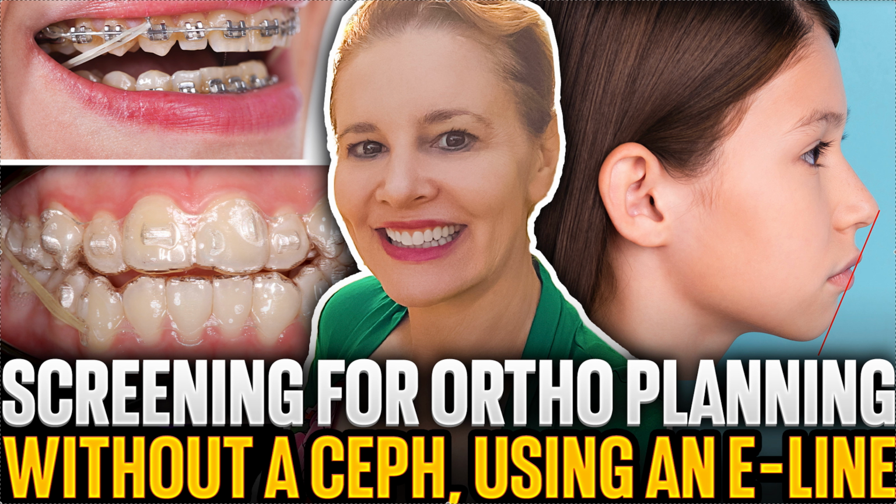Let's talk a little bit more about E-lines and treatment planning. Let's talk about that as a first round treatment planning. What if you don't have a Ceph machine? Now, I'm not going to tell you whether or not you need a Ceph.